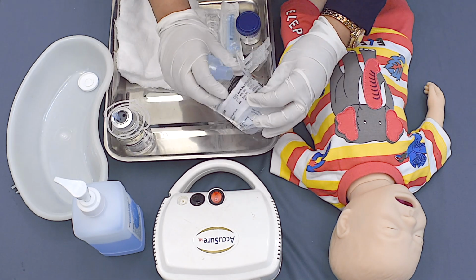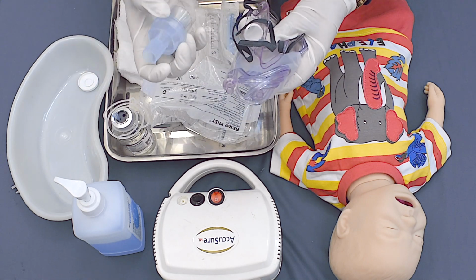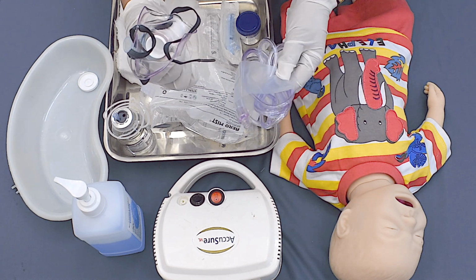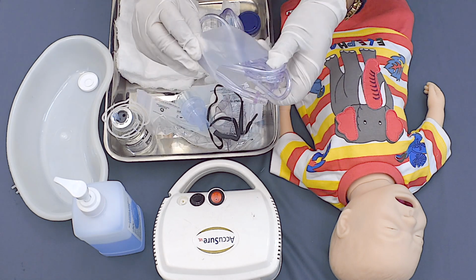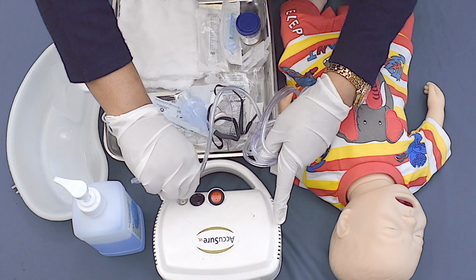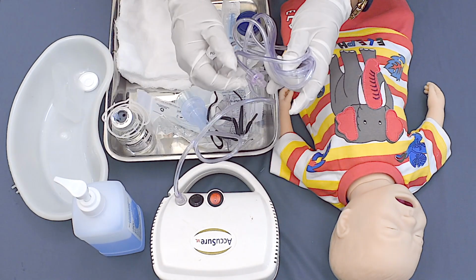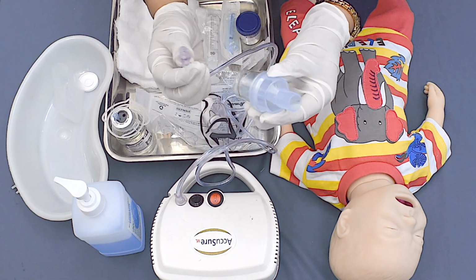Open the nebulization kit. This is the nebulization kit. This is the face mask and this is the connecting tube. Do not touch the inside of the mask. Open the connecting tube and connect it to the nebulization machine. The other end of the tubing is to be connected with the nebulization kit.